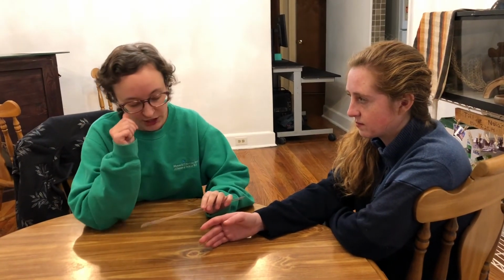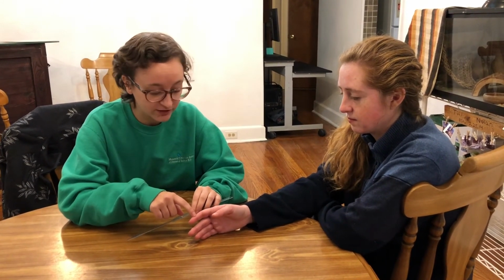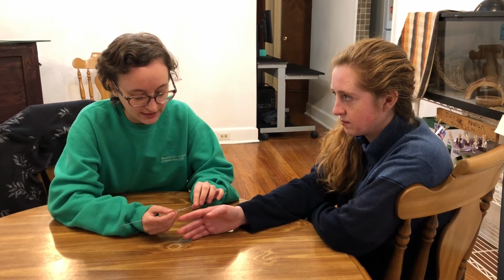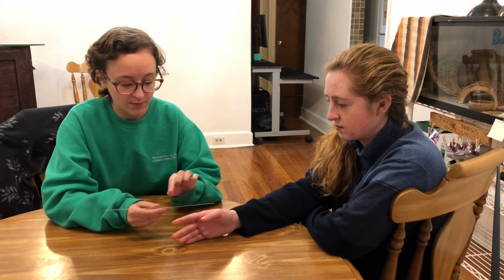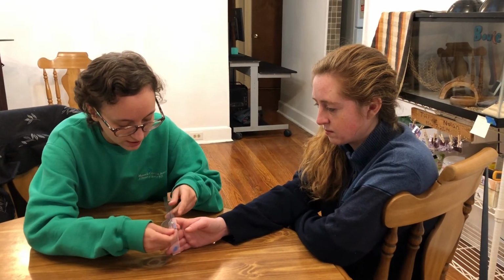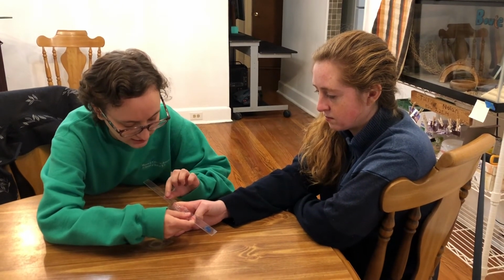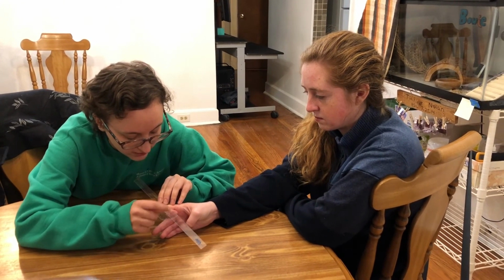So now I'm gonna do flexion of the DIP joint, which is this furthest joint of your finger here. So what I'm gonna do is place my fulcrum on the DIP, but when she bends her finger, I'm gonna have to have my stationary arm in line with her middle phalange of the finger. So go ahead and bend your finger just like we did for the PIP. Okay, great. So that's why I now have my stationary in line with her middle phalange. And again, my fulcrum's on the DIP.